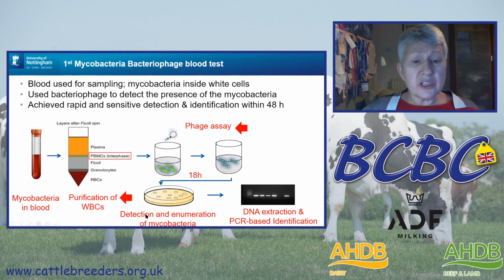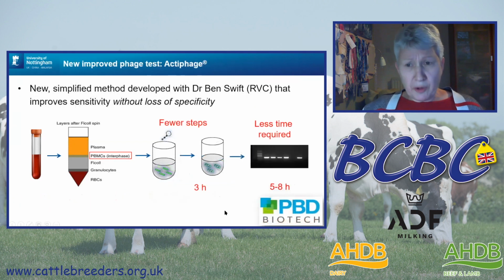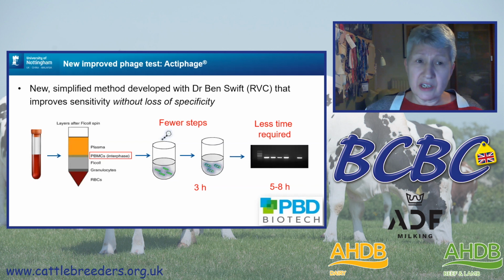But that allowed us to count the number of bacteria present and then extract DNA from that to carry out identification and confirmation of which mycobacteria we had identified. Now, that's very complicated, and it's not what we now call Actiphage.